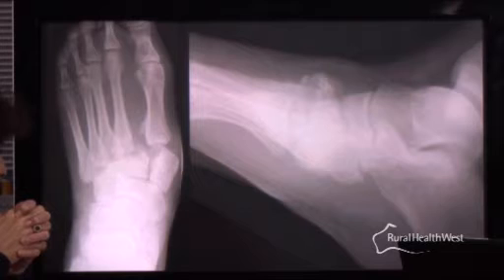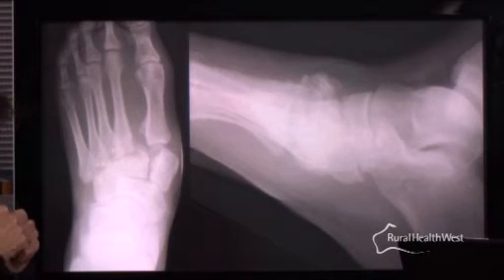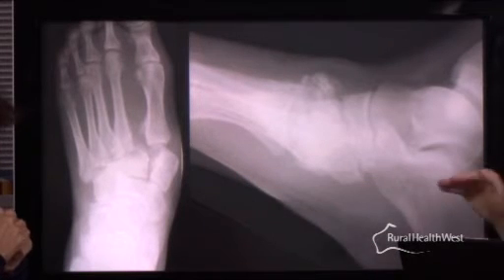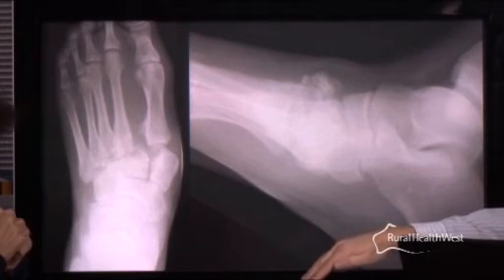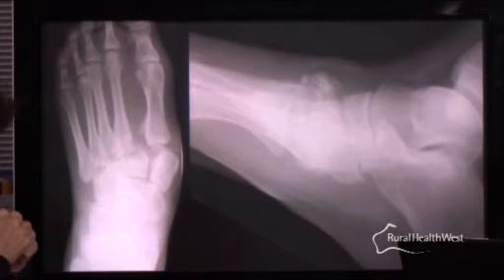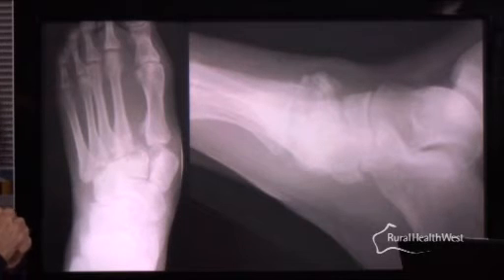Well, this is a case where it was missed in a young football player. And 6 months later, it's like a disaster. This is what occurs. So basically all the second to fifth metatarsals have all slid off laterally. He's got exuberant osteophytes and callus, and really that is beyond doing anything at this point. I guess he would end up with an arthrodesis or something like that at some point in time. Arthrodesis and a large quantity of insoles and support structures.